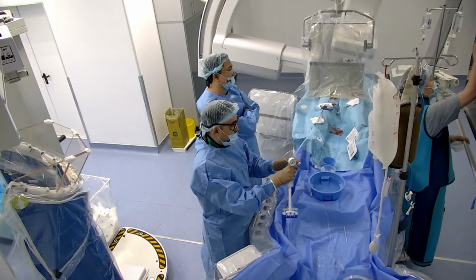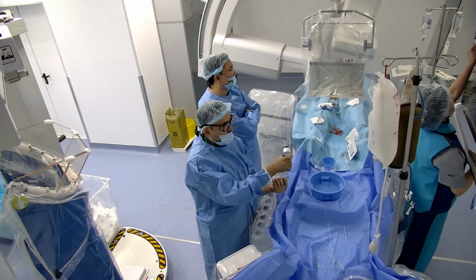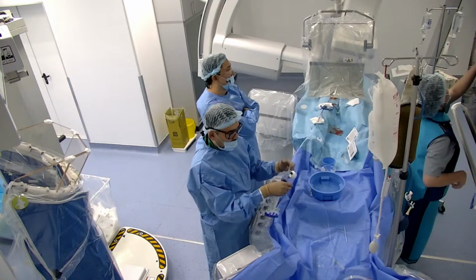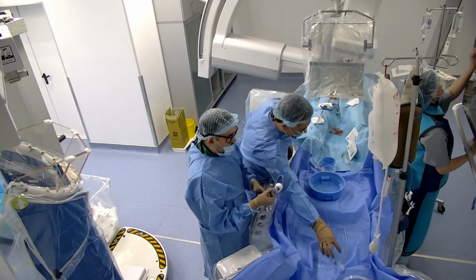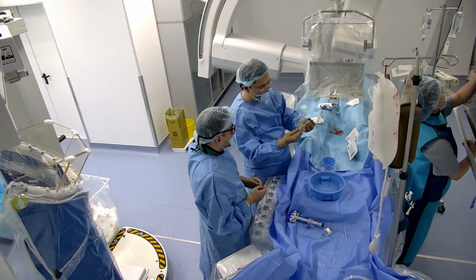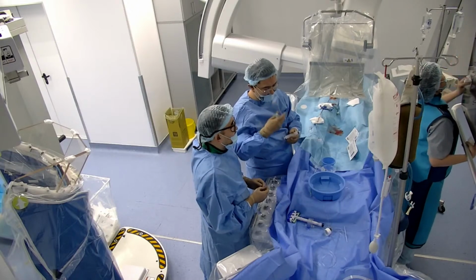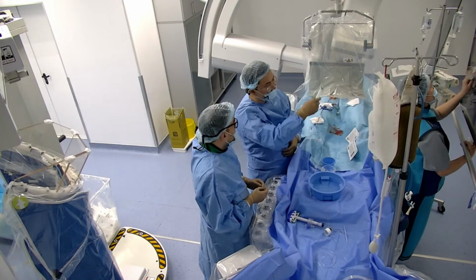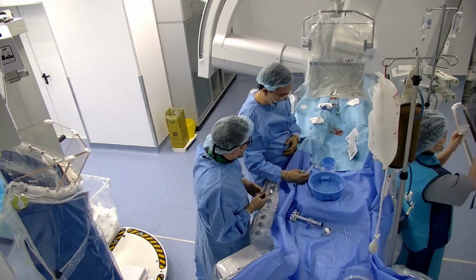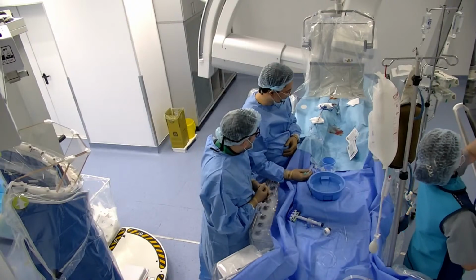And when we try to explain to the hospital administration why we need the exact material, as I said, what the difference between this syringe and this syringe? Both are syringes. And this is luer lock, it's more secured, and there is no leak for the eyes and for the environment. I have no words to explain.